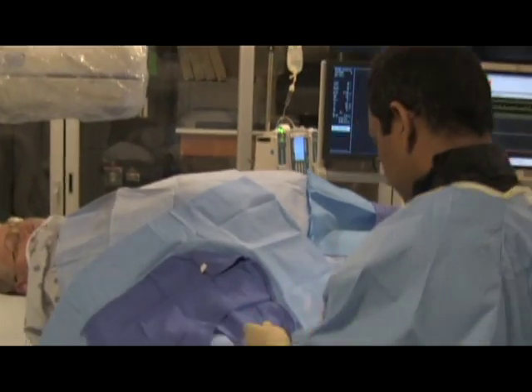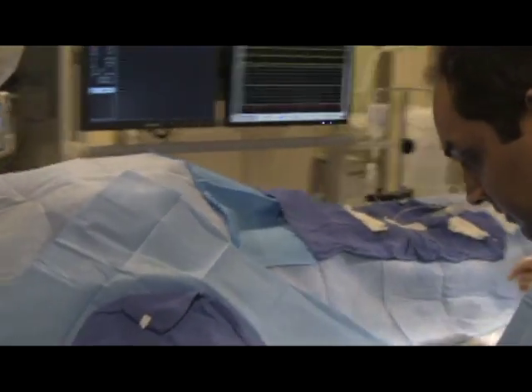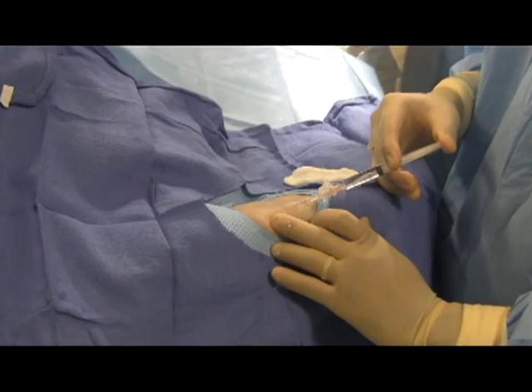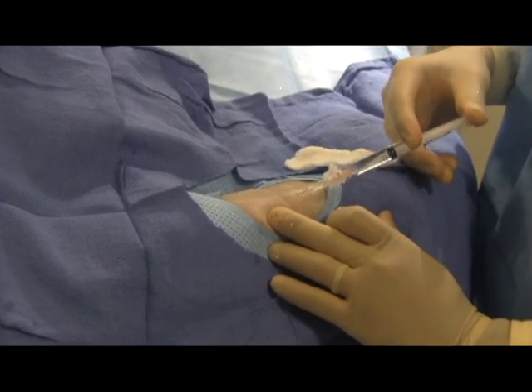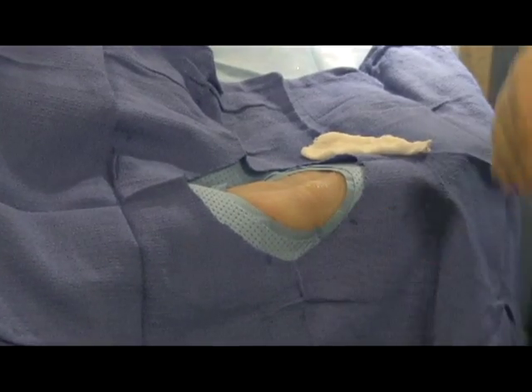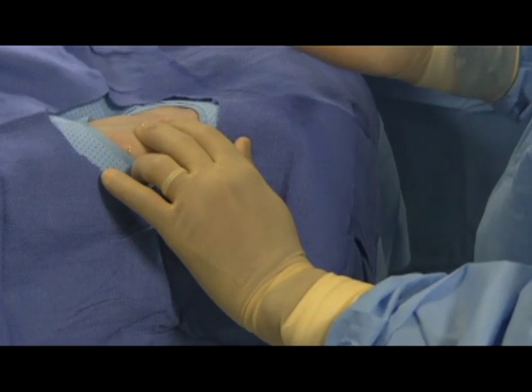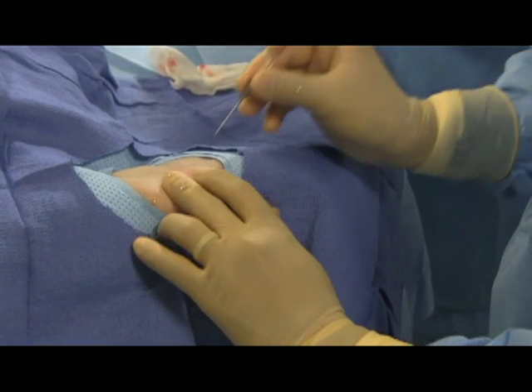Dr. Patel is going to start localizing the wrist area now. Typically only a couple of cc's of numbing agent to the patient's wrist. Dr. Patel is going to be gaining access to the right radial artery with an angiocatheter at this time.